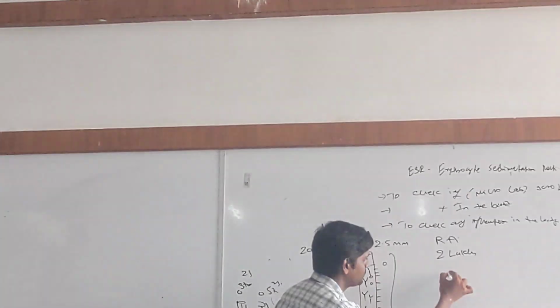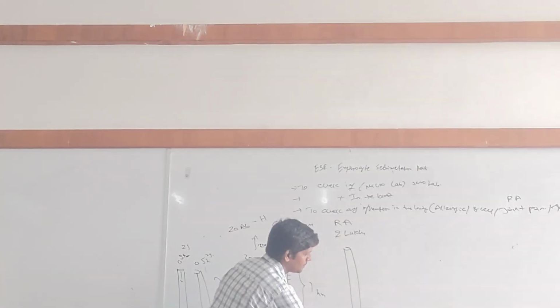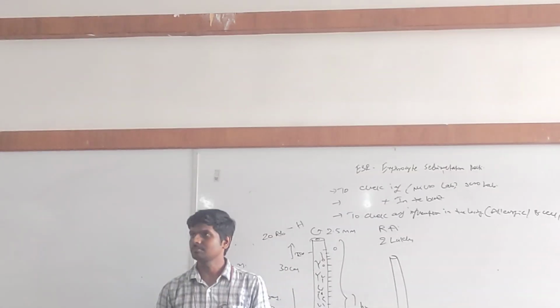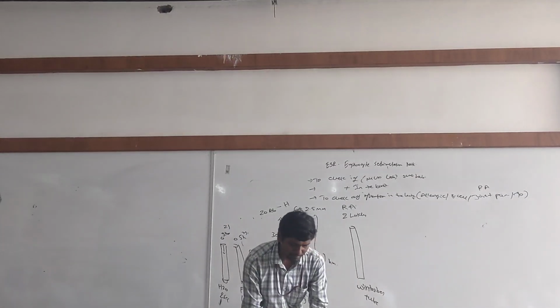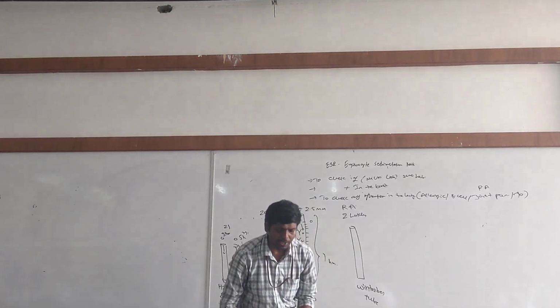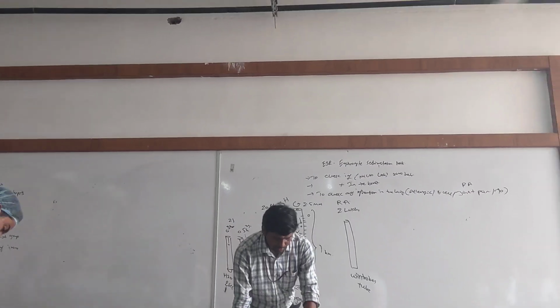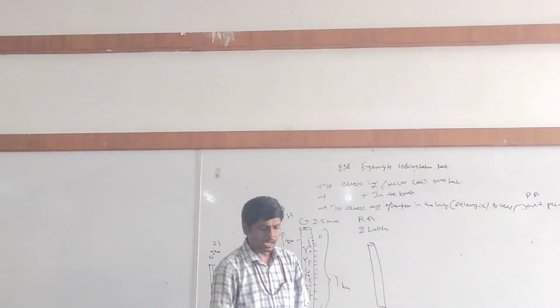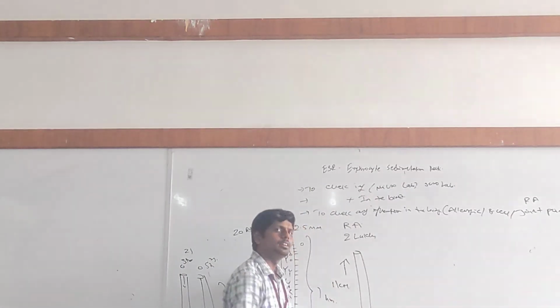Wintrobe's tube. Write down the properties of Wintrobe's tube. It is 11 centimeters long.